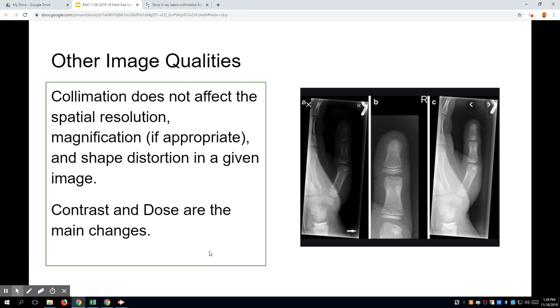So this image is up here again, and I know I showed it to you before, but these were the days where you had to work a little bit harder because you had to collimate not just one image, but three. You used to have to take your cassette. I don't want to get too historical, but there were little notches, and you had to visualize a cassette in thirds and try to make it all match. And they're coming back to this because there are algorithms now.